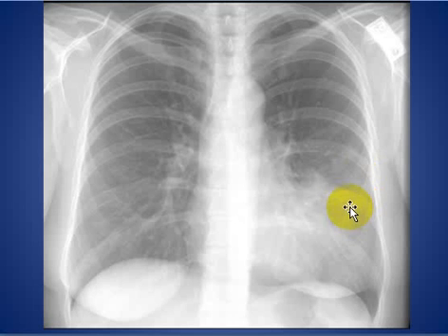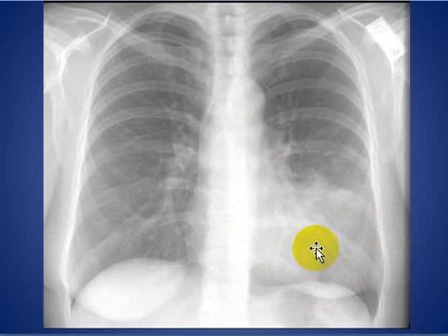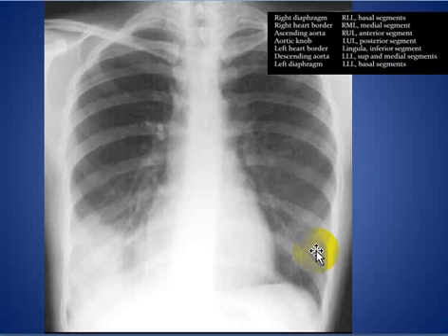In another example, you can see the heart silhouette and there is an opacity obliterating the left cardiac border on the lower margin. According to the silhouette sign, that opacity should be located anteriorly and should be in the lingula, inferior segment.